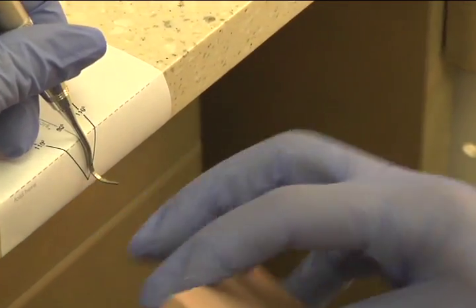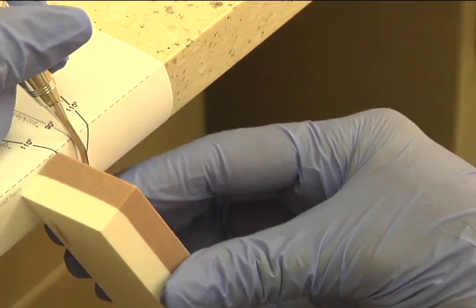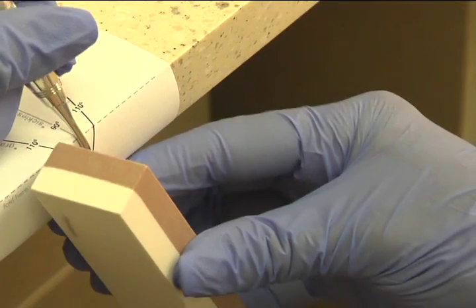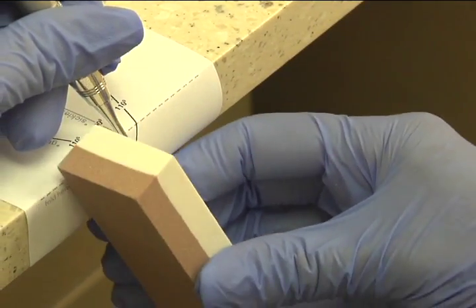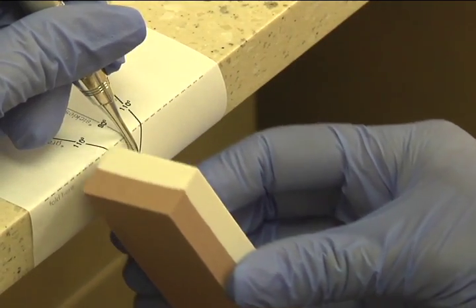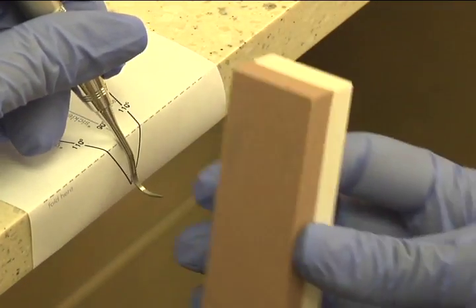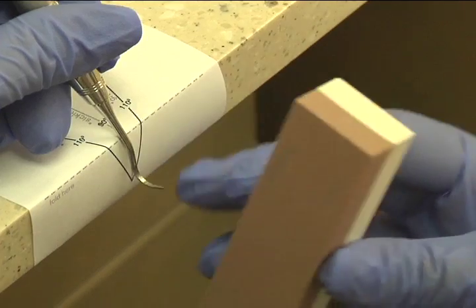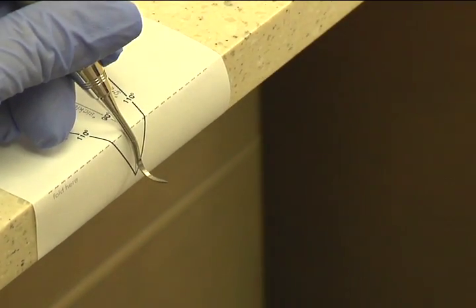And again, I'm applying pressure here, and I have the back, middle, and the toe, and the back, and the middle, and the toe. So as you see, the stone is always at the 110. I'm sharpening the blade at 110 degrees on both sides. And that's the H67.